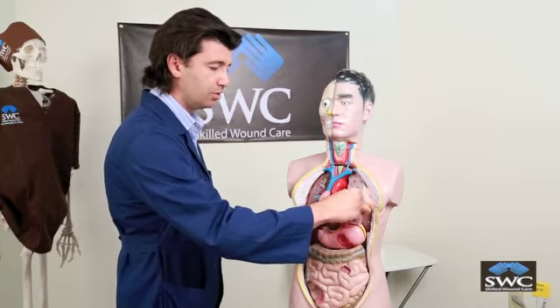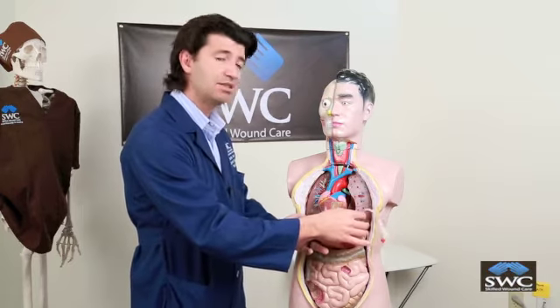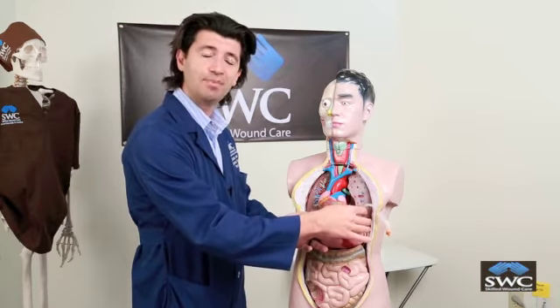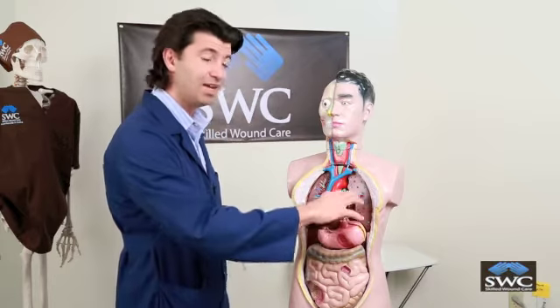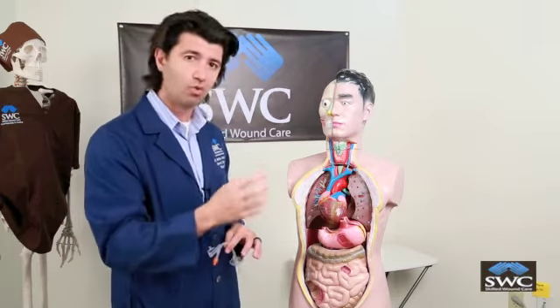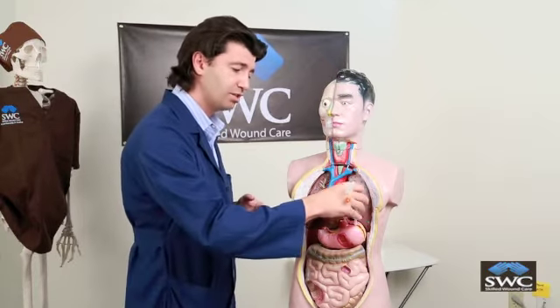What happens long-term to gastrostomy tubes? Well, as they stay in the stomach, these gastrostomy tubes slide back and forth in the stomach. This sliding back and forth causes the patency of the hole to increase, and suddenly you will start to have leakage manifest itself at the outer surface of the skin. This will cause a peristomal dermatitis or a rash around the stoma of the gastrostomy that can only be fixed by upgrading the gastrostomy to a larger gastrostomy tube.